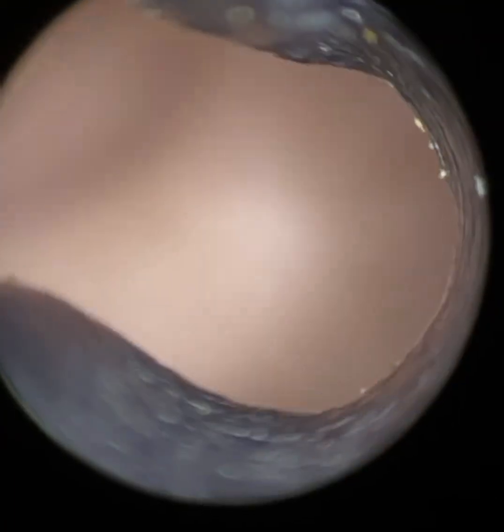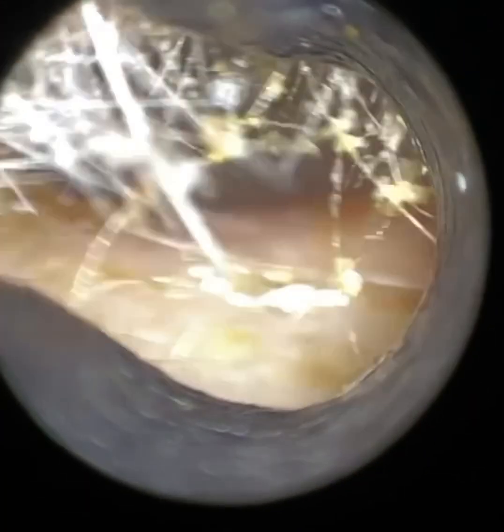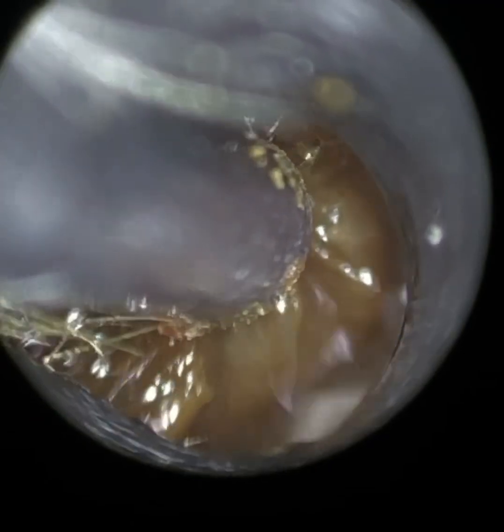You can just see the clarity that's offered by our Waxscope — it truly is crystal clear. So you can see just how narrow this ear canal is, so I have to stretch it open. And then once I'm in, I'm dilating the ear canal and we can visualise the wax. I've just put some olive oil drops in there.